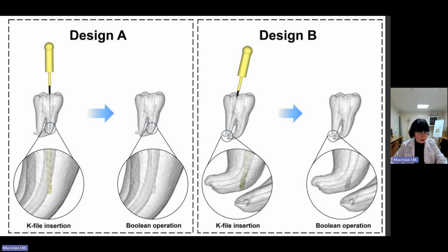Carious dentine is always removed, and any filling or restoration that prevents direct view to the root canals is removed as well. Also, all undermined cusps are reduced at this time in order to prevent crown-root fractures during the treatment of the root.